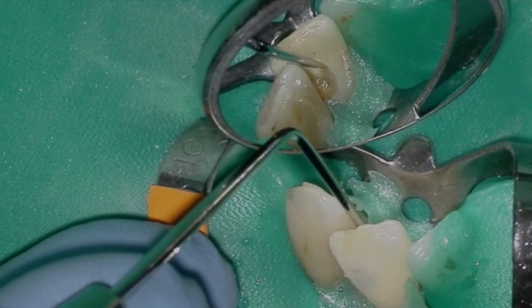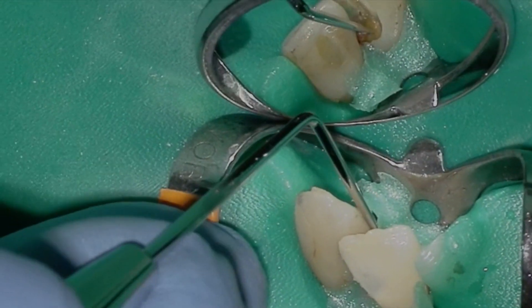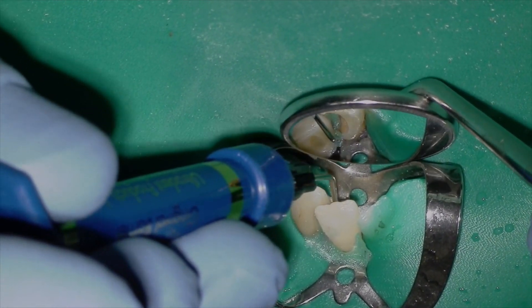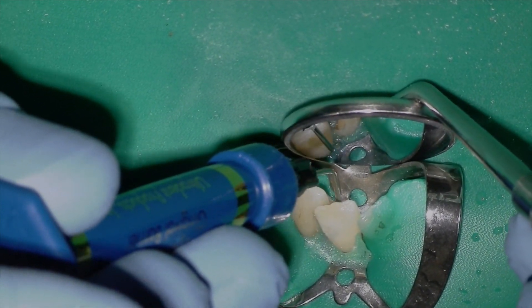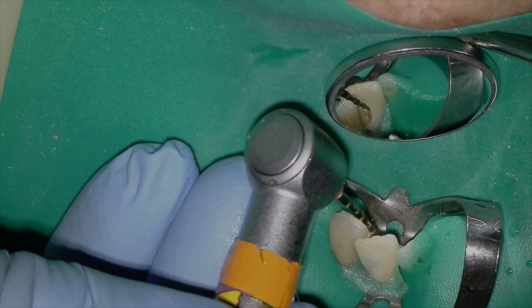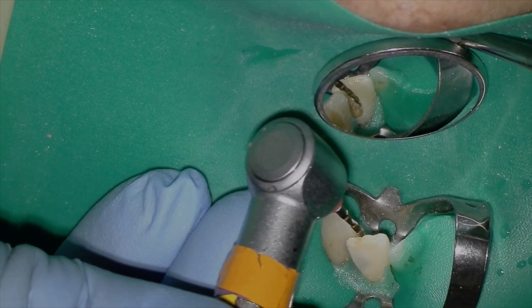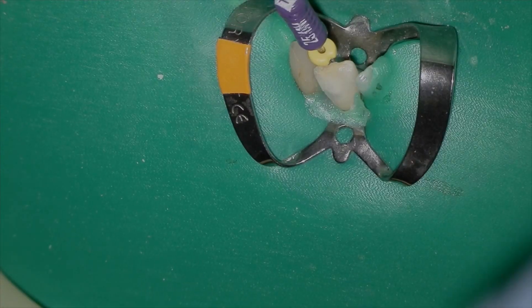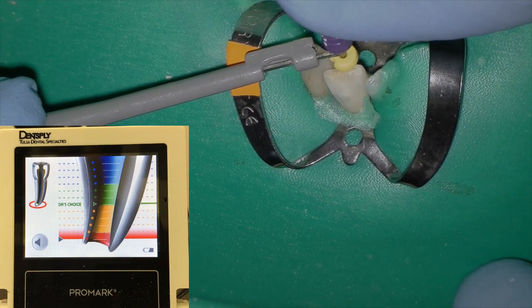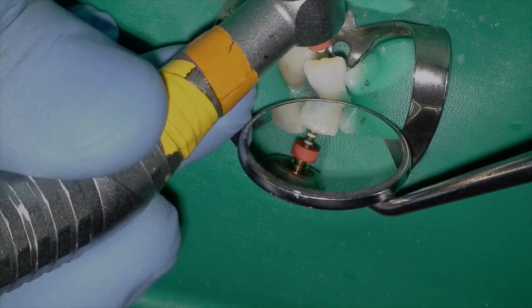Now I have my access into the pulp chamber. I need to reseal the tooth from the oral cavity with more Opal Dam, just to make sure we don't get leakage of that irrigant into the oral cavity. Now we're going to start cleaning and shaping our coronal two-thirds with our Wave One Gold primary. The beauty of this file is I use it as my orifice opener and for cleaning and shaping. I'm going to get my working length with the number 10 file — to the red bar on the Pro Mark — and subtract 0.5 millimeters. So now I'm going to clean and shape to 20 millimeters with my primary file.